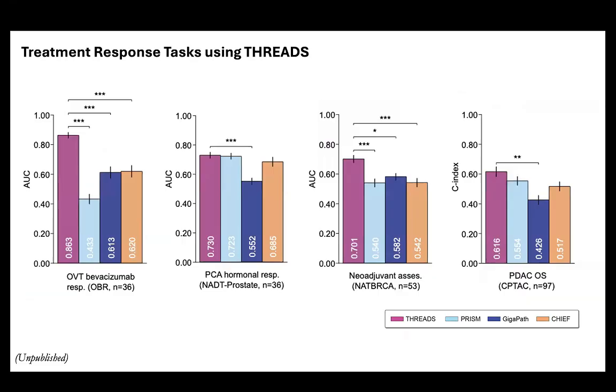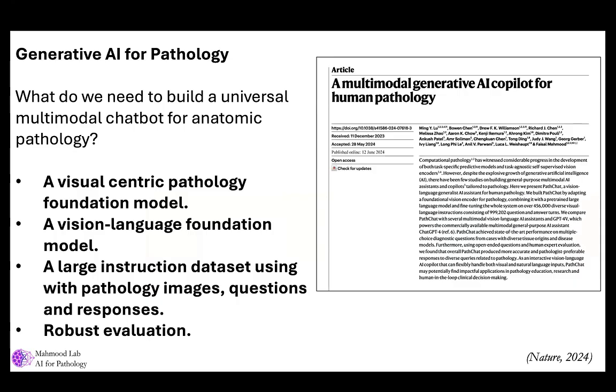So there's an example for tasks that are typically just difficult and challenging, but when you have this kind of a model that you're contrasting with molecular representations, you can improve image representation substantially. And treatment response is a difficult task to begin with, because we often don't have pre-treatment biopsies available to us, and any data set available is typically very small unless it's very carefully curated. It's changing, but this is the current state today.